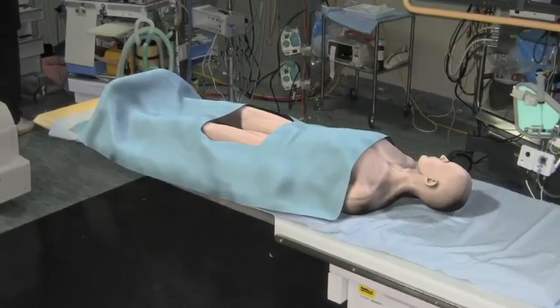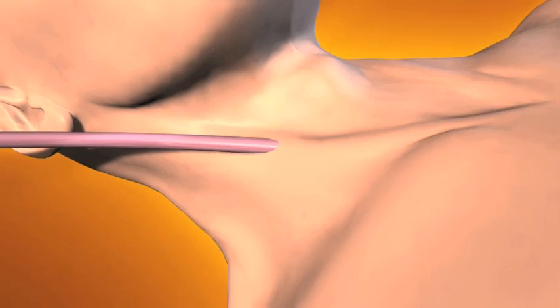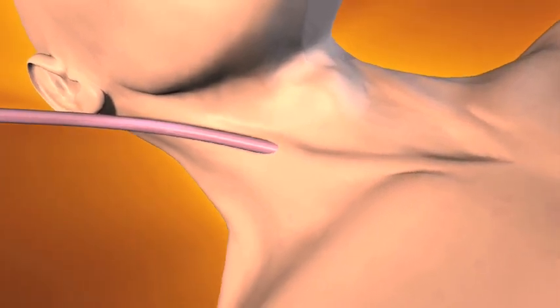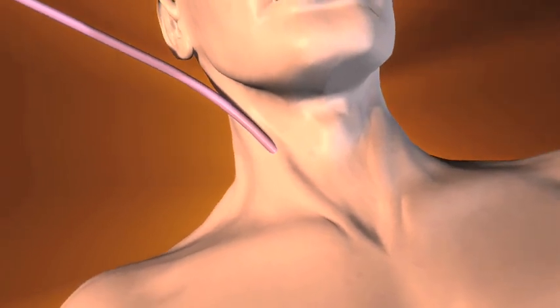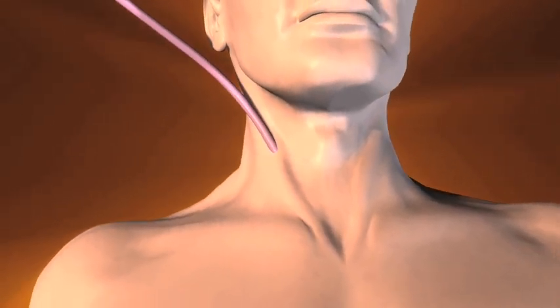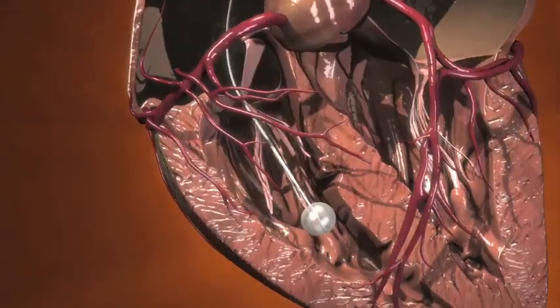Make sure that the patient is comfortable and in a supine position on the cath lab table. Establish a central venous line. Insert a 4 or 5 French temporary balloon tip pacemaker catheter via the right internal jugular vein or other appropriate access vessel and position it in the apex of the right ventricle.